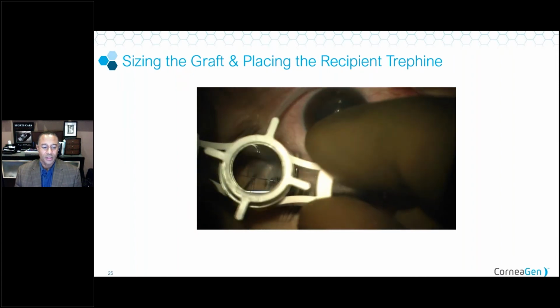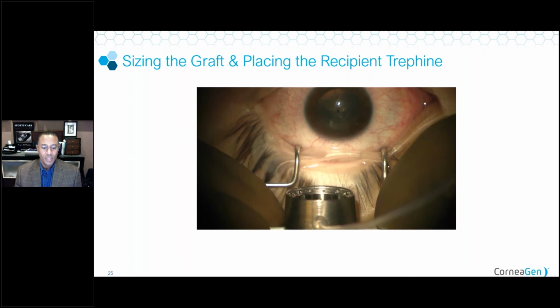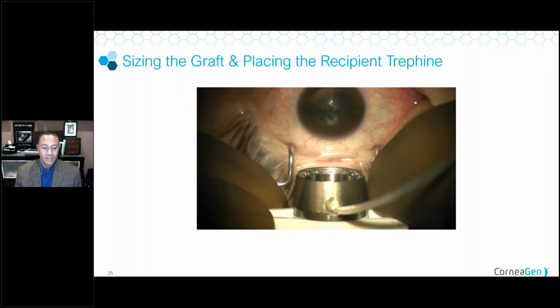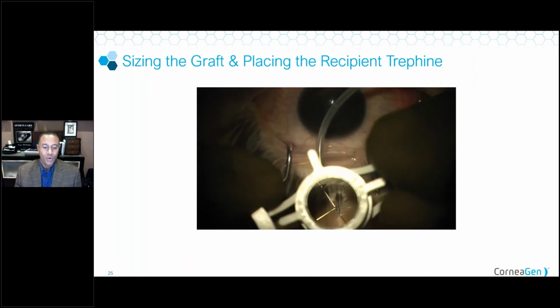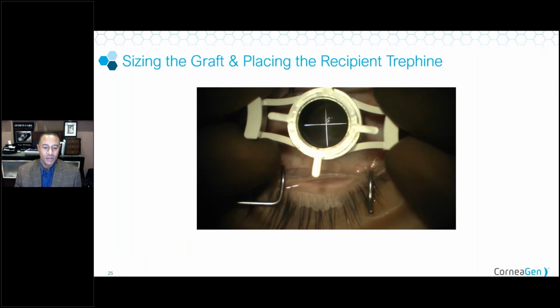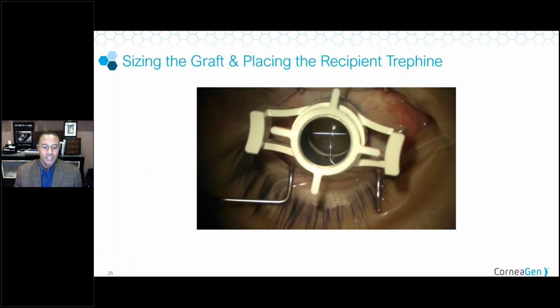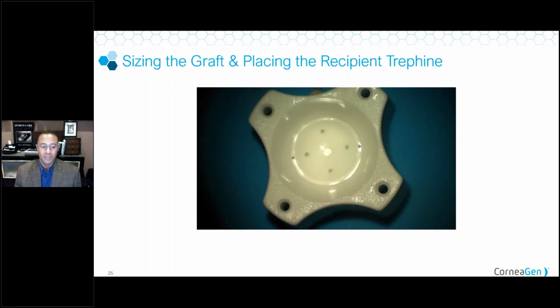After that, we pull out the Barron trephine. This is the recipient trephine. It has a little print of 8.5 on there. We look at the barrel. There's an inner blade and an outer barrel. We're going to advance that inner blade to match up with the outer barrel. You can see that there. Then we back up three-quarter turns, and check to make sure we went in the right direction. And now we're ready to place that trephine on. So close one eye, looking through one ocular of the operating microscope, center the crosshairs on our center mark and apply suction and let that sit. We want that to sit for a good minute at least. I just let it go ahead and sit while I'm completely preparing the donor. And next slide.